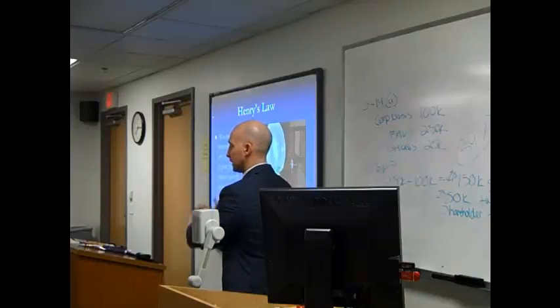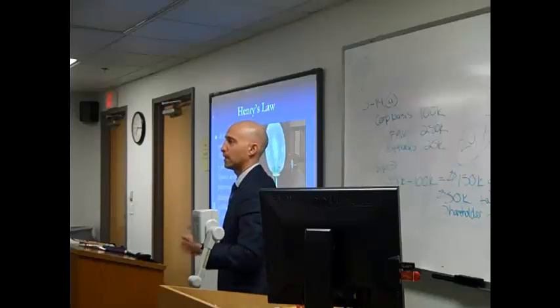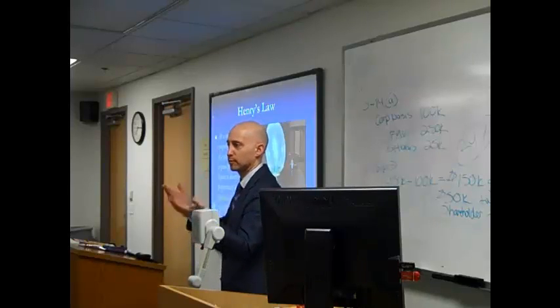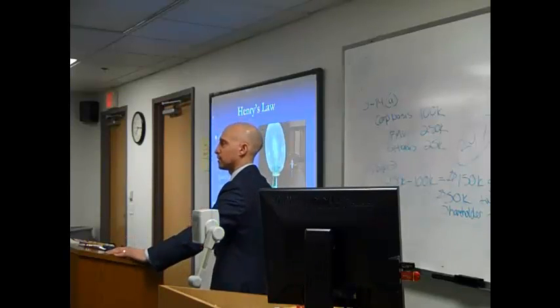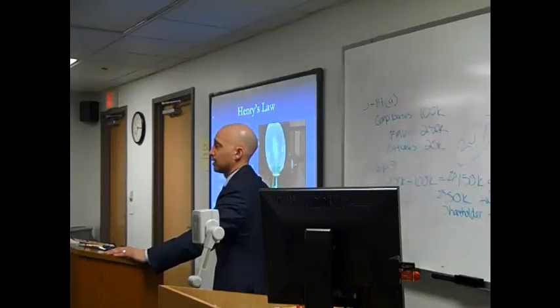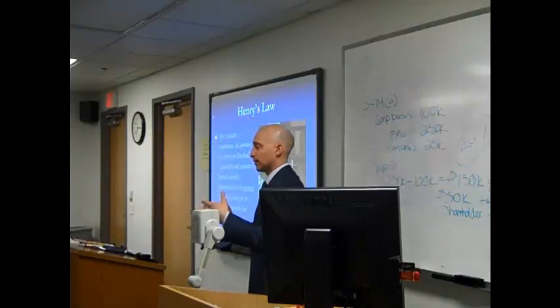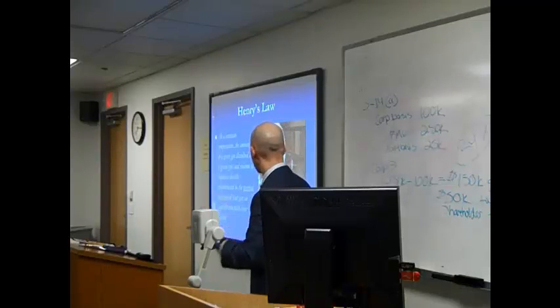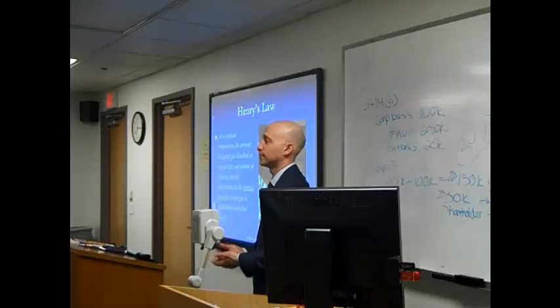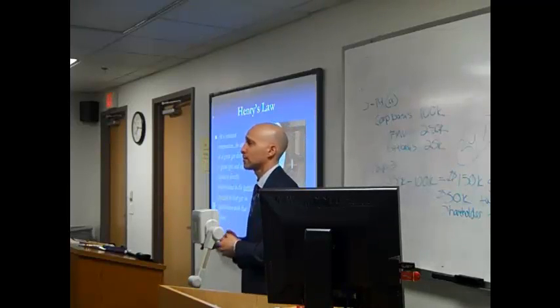If you let this bottle stay at room temperature, and then you take off the cap, what happens? You see the bubbles. They just come up, right? That's essentially the process of Henry's law. And if you put a balloon over a bottle, the balloon fills with the carbon dioxide because it's all escaping. Essentially, the warmer it gets, the more the carbon dioxide in the liquid wants to escape into the air above it. All right, and that's essentially what's happening with headspace gas chromatography.